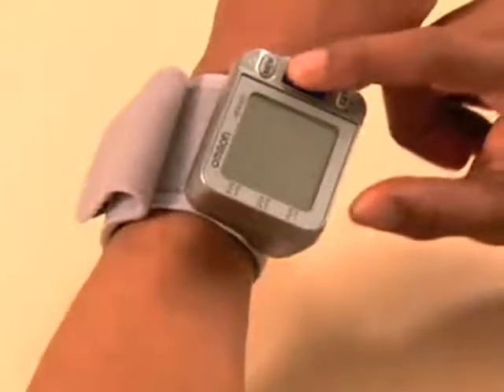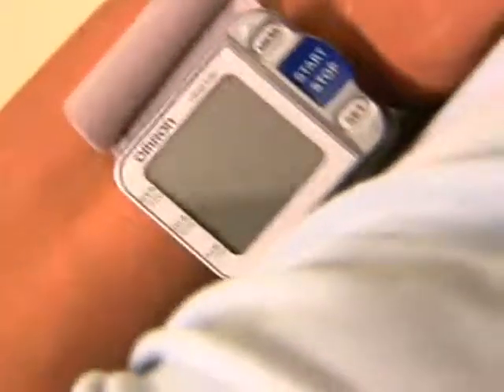To turn the unit on and take a measurement, press the start-stop button once. The monitor will start beeping.